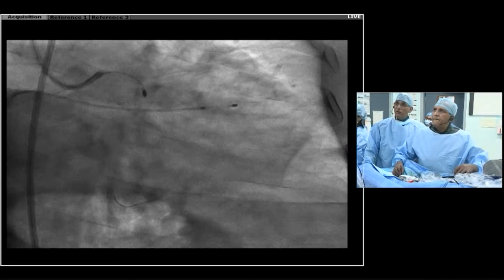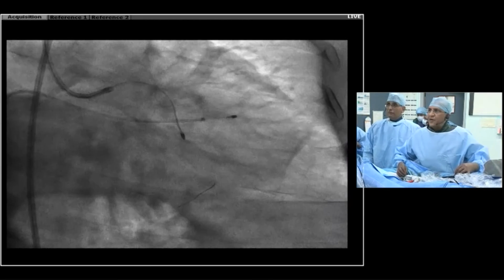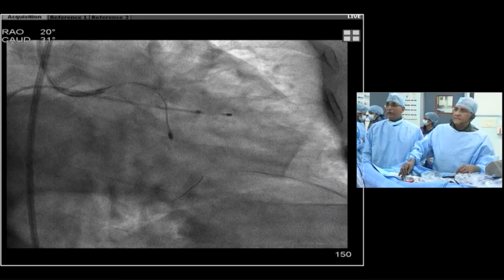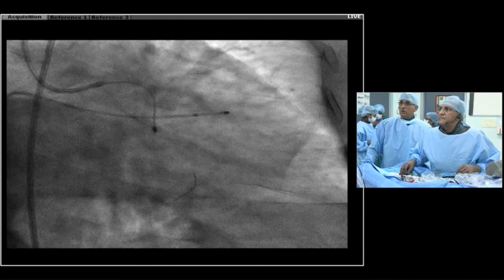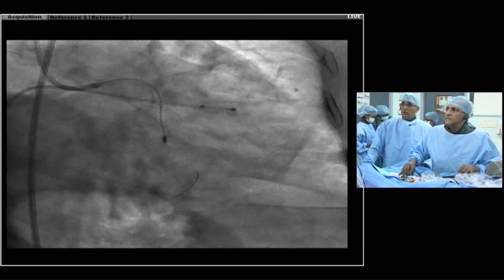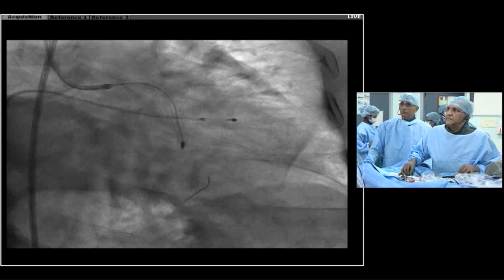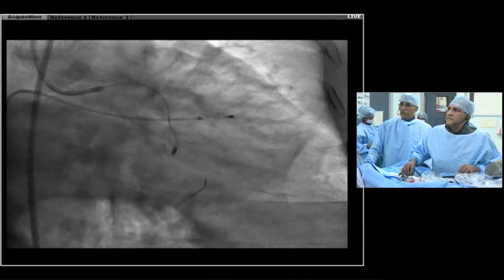Yeah, Kirti, we are back with you. We can stay with you for 5 minutes and then we need to go to our break. This is a new 1.5 burr. Yeah, I think there is a little movement this time. We can see the new 1.5 burr entering the lesion because that's the bend.